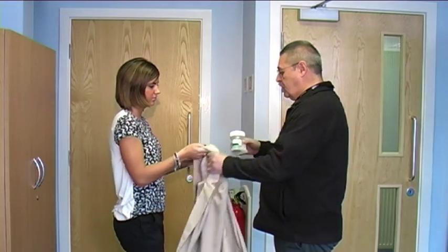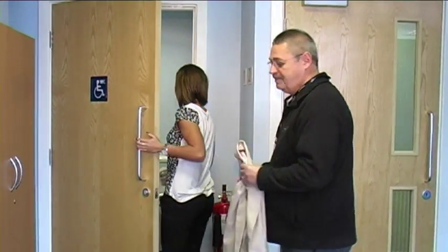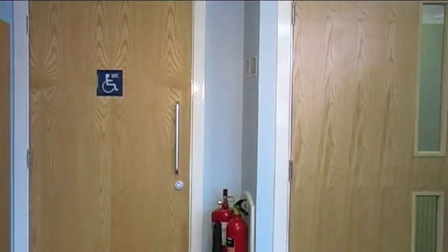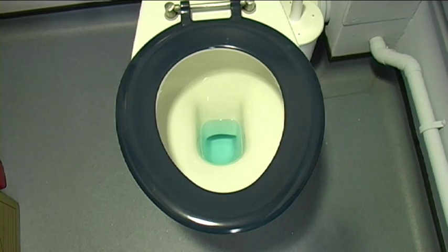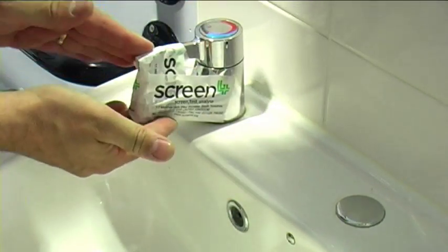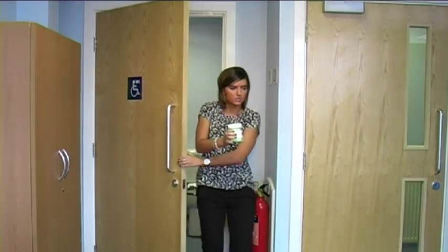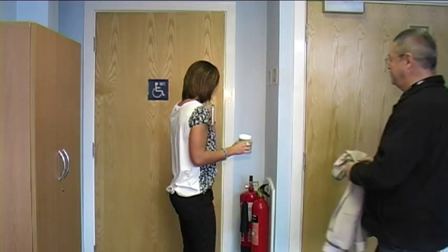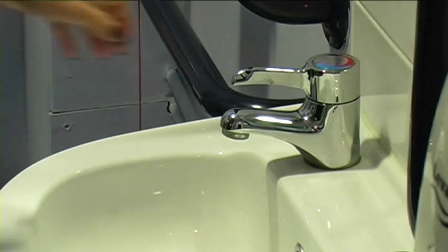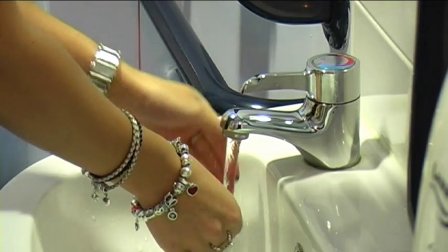The Screen 4 integrated testing cups have various adulteration checks incorporated into their design to ensure a valid sample is provided, including 1. Temperature check, 2. pH check, 3. Creatinine check. Once sufficient sample is collected, the donor should screw the lid firmly back onto the cup and return it to the technician. The donor may now wash their hands.